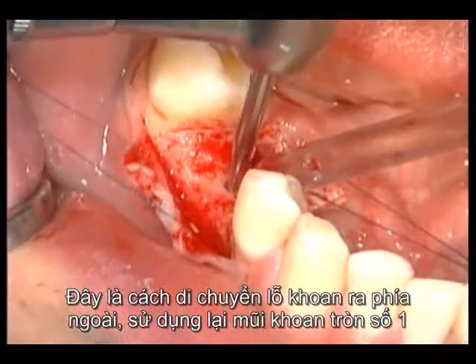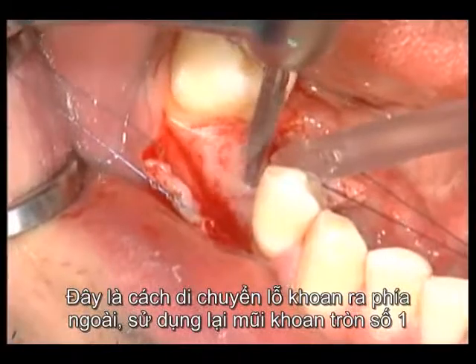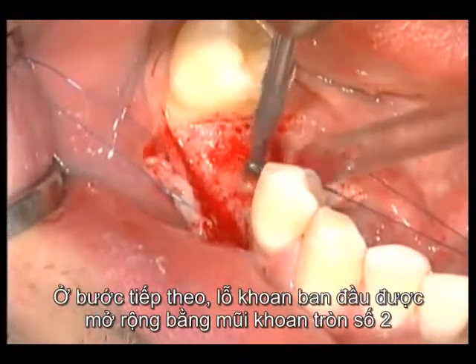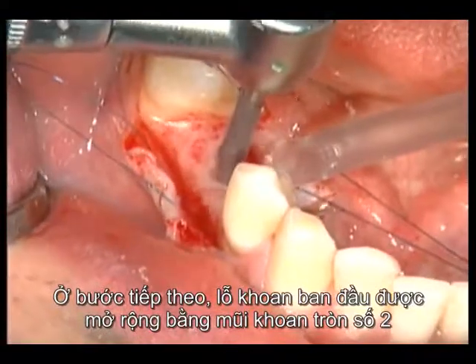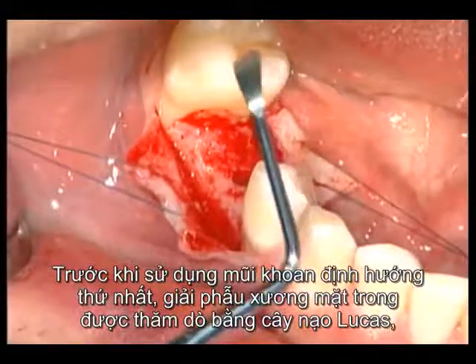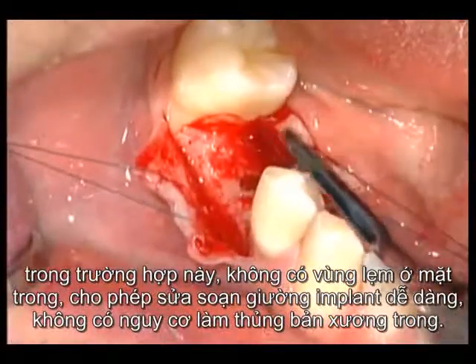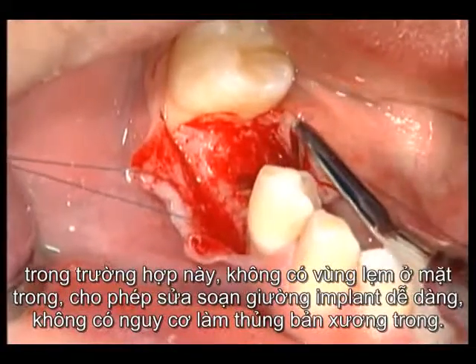This is how the preparation is moved buccally, utilizing the first round burr again. As a next step, the initial preparation is enlarged with the second round burr. Before the first pilot drill is used, the lingual bone anatomy is explored with a Lukács instrument. In this case, no lingual undercut is present, allowing easy preparation of the implant bed without the risk of lingual perforation.